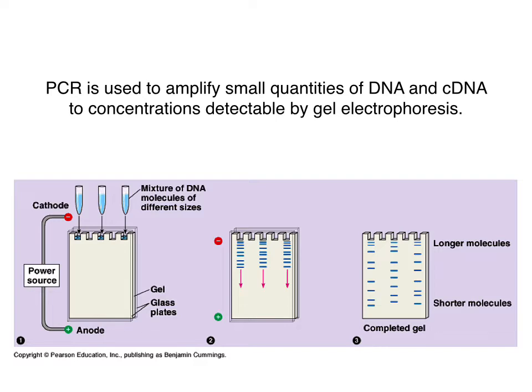Because the pathogen does not need to be cultured before detection, it is possible to detect a single pathogen or many related pathogens in less time and more cheaply. This procedure is useful for detection of animal and plant viruses and is being used more and more for fungal and bacterial plant pathogens in our disease and diagnostic clinics.